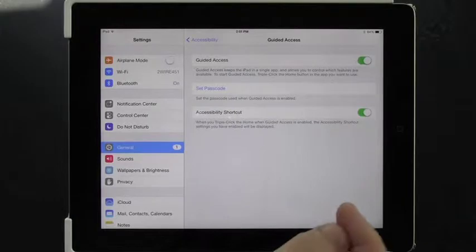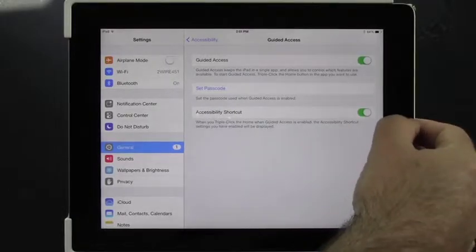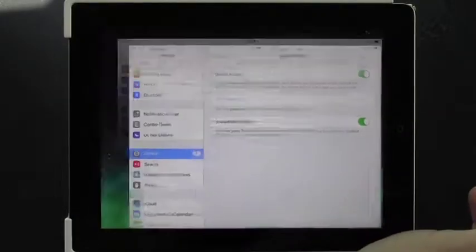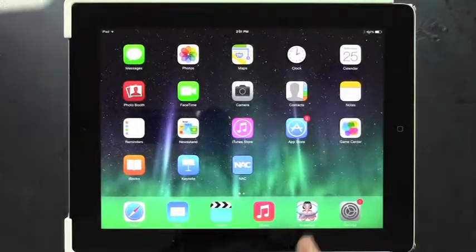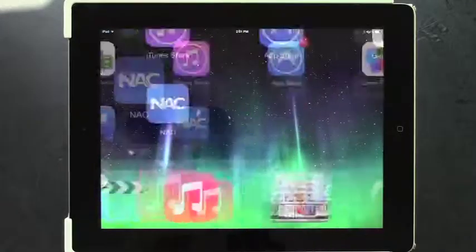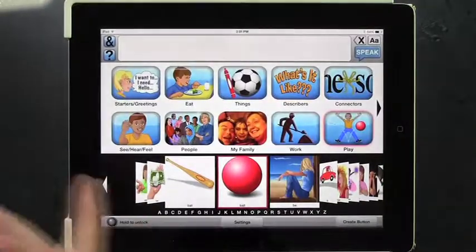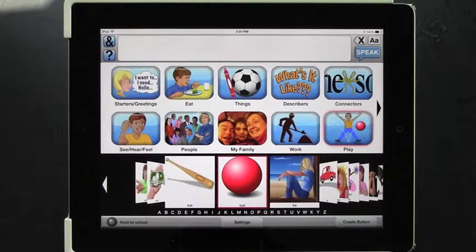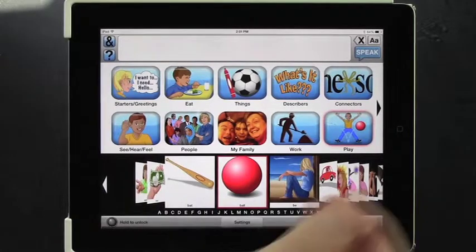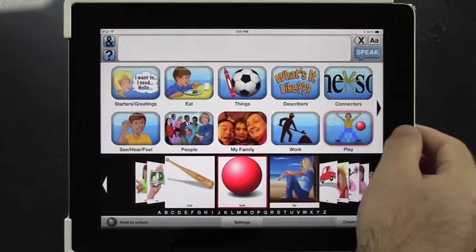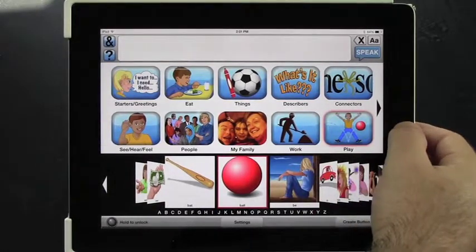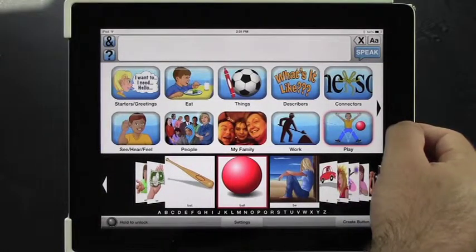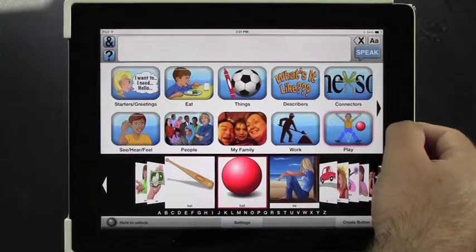Now we exit by hitting the home key. Enter your favorite app — I already had AvaTalker launched. Now, in order to activate Guided Access, you hit the home key three times in rapid succession: one, two, three.